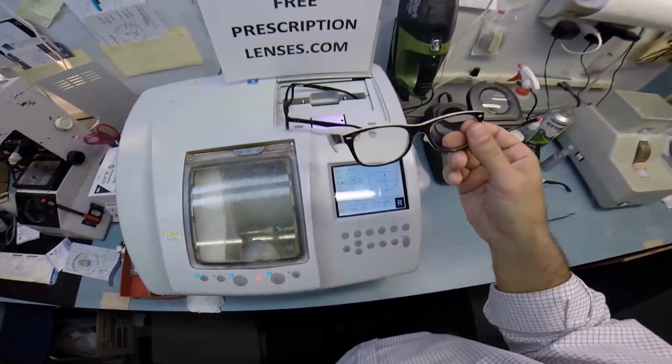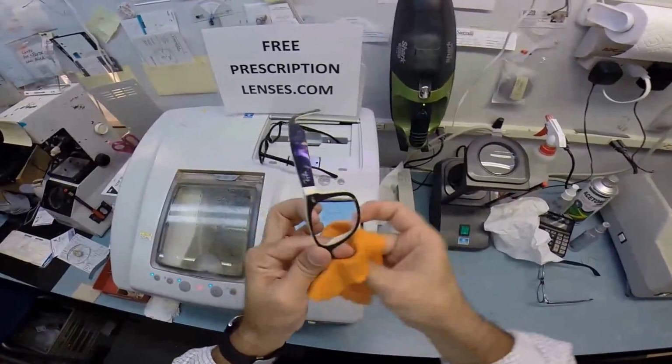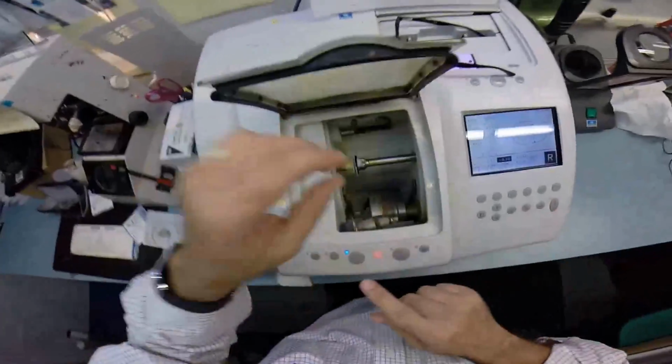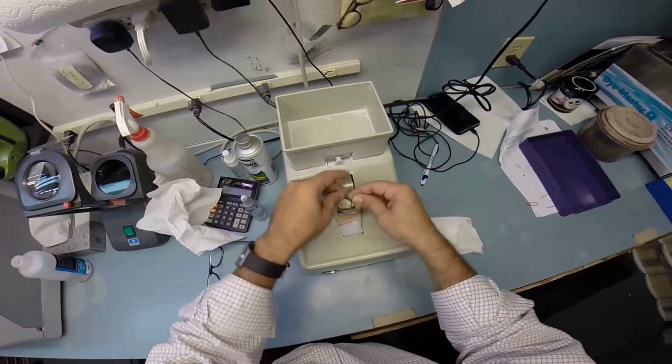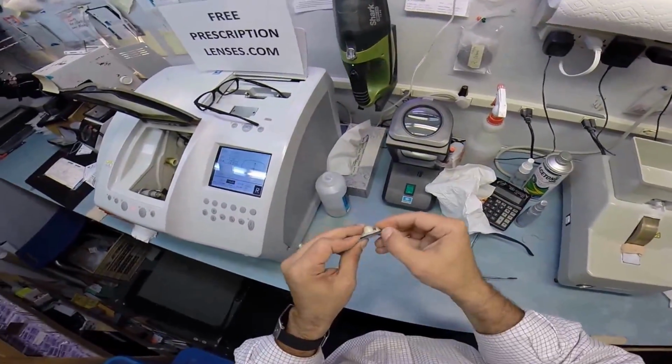And of course, as I mentioned, your lenses are unbreakable and bulletproof, so you will not hurt your lenses by popping them in and out of the frame, and you will not hurt your frame, providing that it's at room temperature when you try and do that. Plastic does get very brittle. I know you're in Austin, Texas, but plastic gets very brittle when it gets cold.